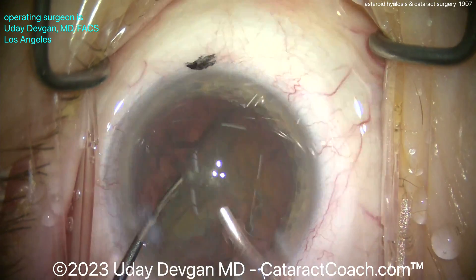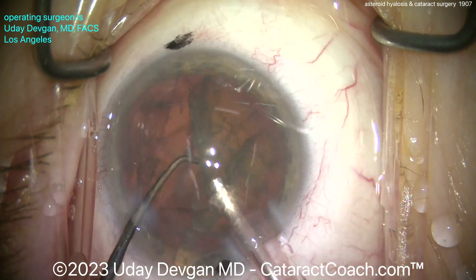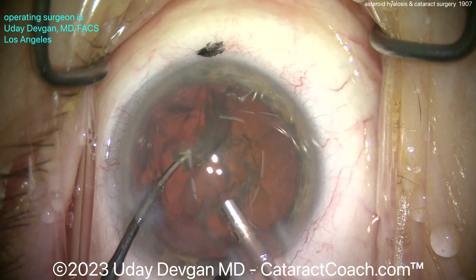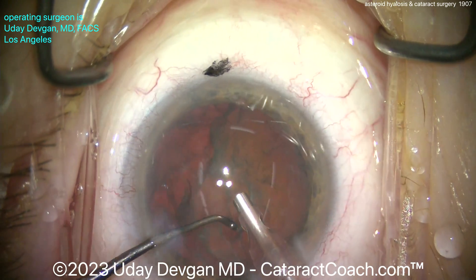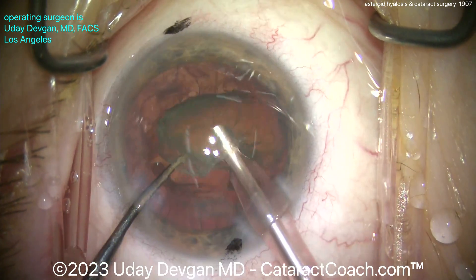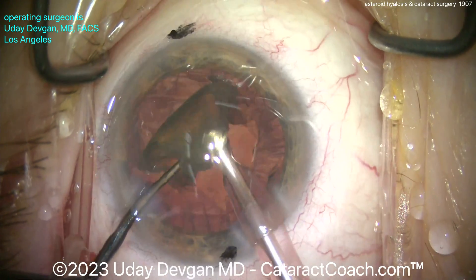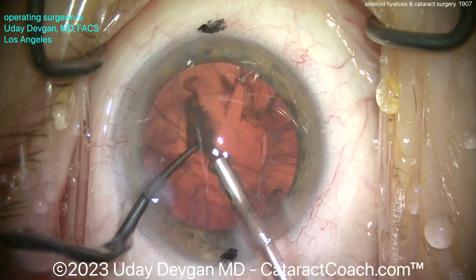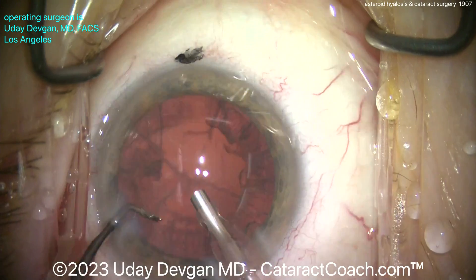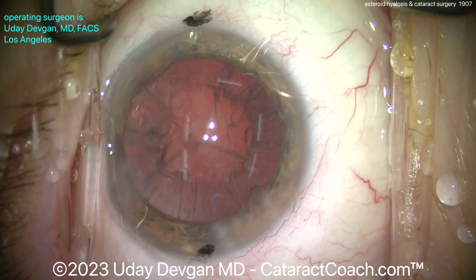The nucleus removal is pretty routine — we've sped the video up to 2x normal speed just to get to the more interesting parts of the case. Once we get to the irrigation and aspiration for cortex removal, we'll slow it back down.